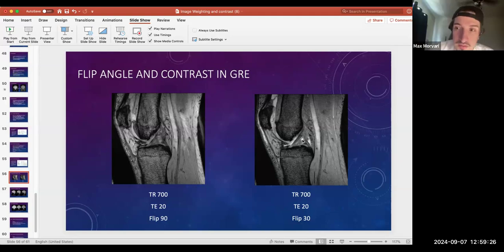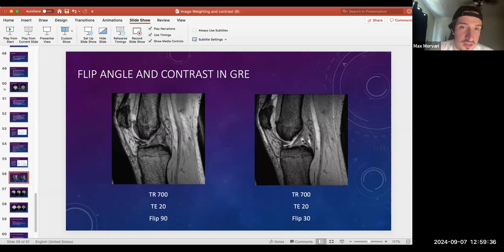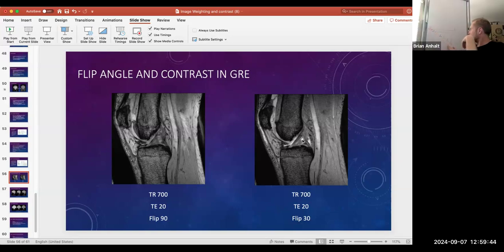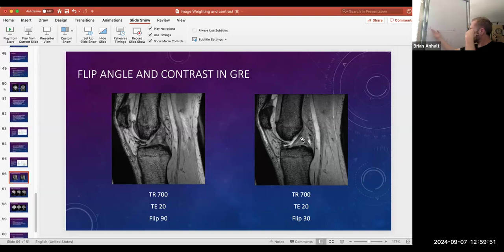We go through that time and time again, hundreds of times, to collect the data to generate one slice. That's what the multi-slice acquisition is: the constant repetition of those echoes and recording the multi-slice data. The multi-slice acquisition is the fact that we're doing many slices within one TR, but we have to go through several TRs per slice to collect enough data to generate one image, depending upon the resolution we desire.